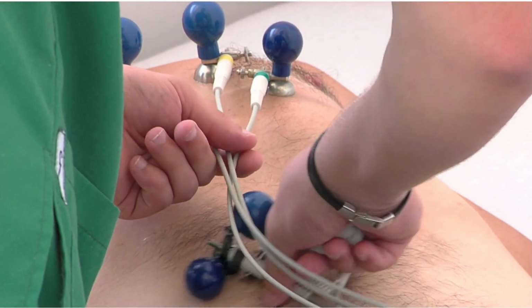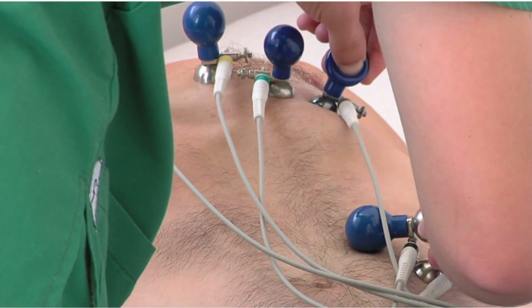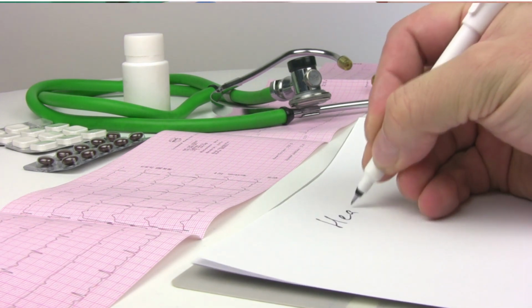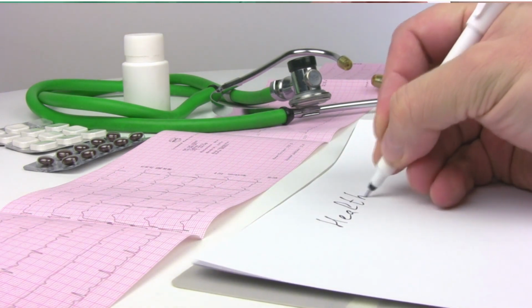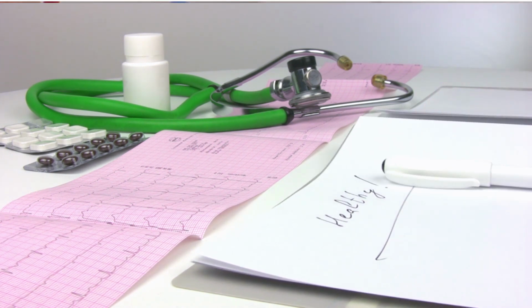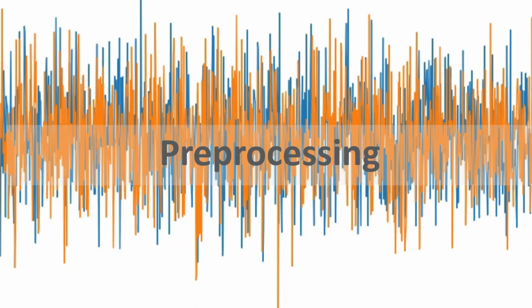These electrodes give the view of electrical activities from different places of the body and thus give different signals for a single subject. The physician determines the heart condition by combining a knowledge base from these different views of electrical activity of the heart. ECG signals are accompanied by high-frequency noise and different artifacts.